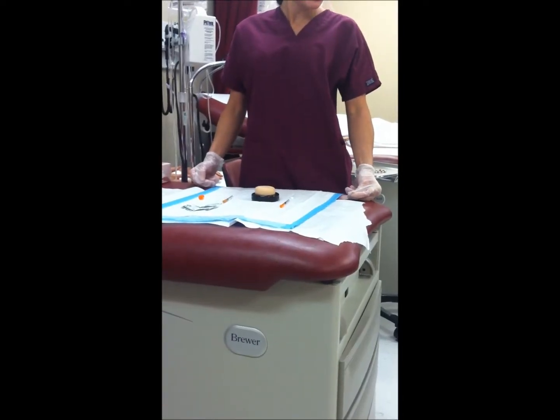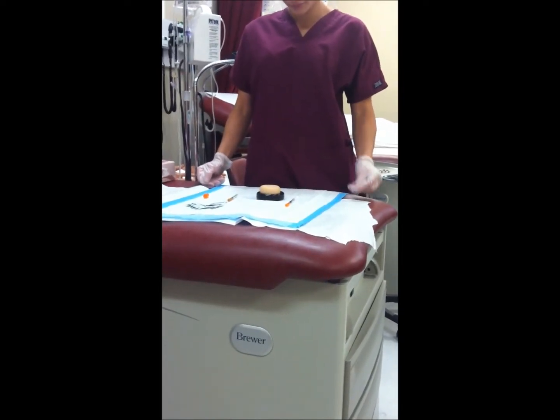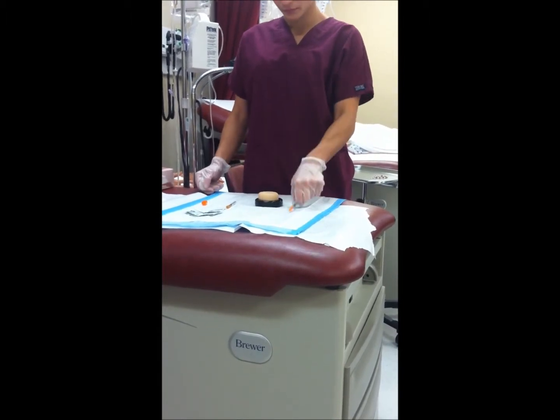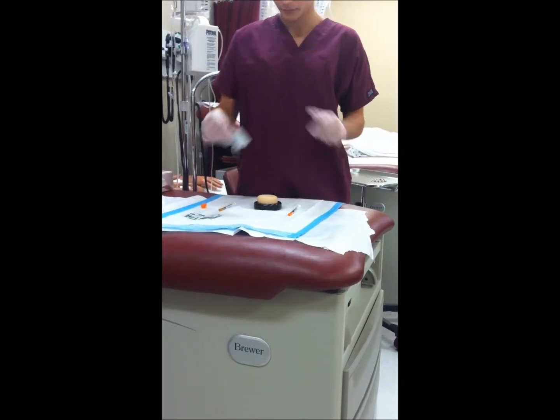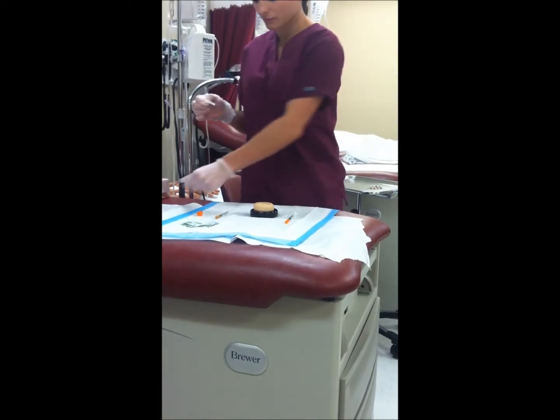This scene is going to be about subcutaneous injections. First, you're going to obtain a 1/2 to 5/8 inch needle. The orange is for insulin, and the brown is for heparin. These can be given in the deltoid, abdominal area, upper hips, lateral upper arms, and thighs.